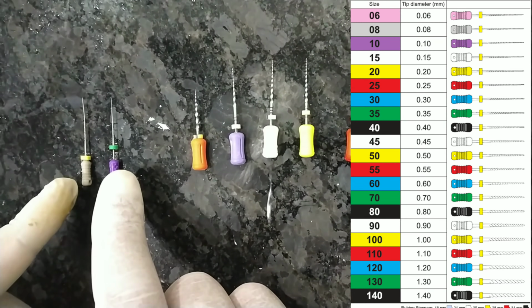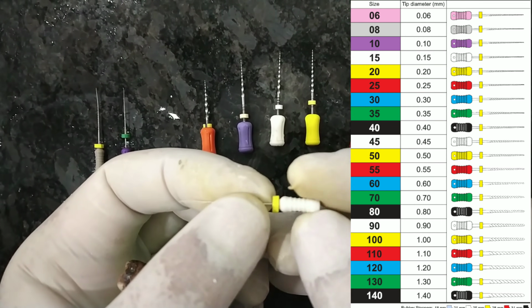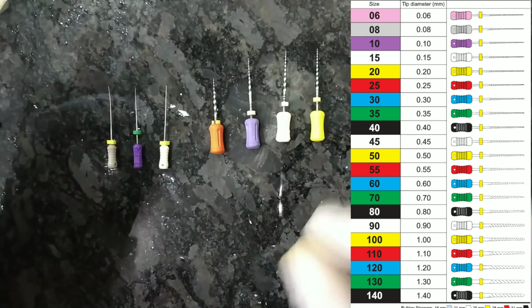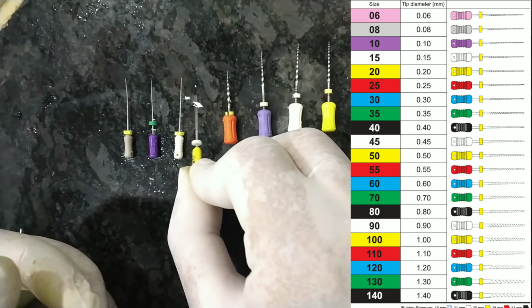These are all 2% files, right? After this, I use the number 15 file for the shaping of the canal. This is number 15, white in color. Then we again use the number 20 K file. This is number 20. As you can see here, this is yellow in color.